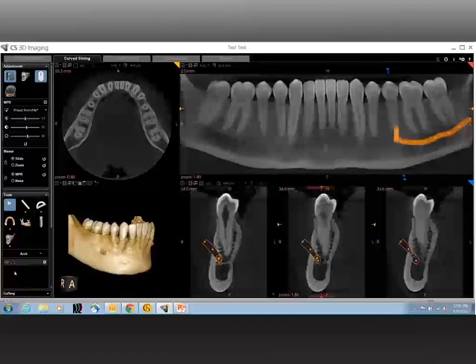Dr. Kottal, I do have one more question for you. I often get asked the question when dealing with a clinician who may not have a cone beam in-house. They ask me, do I have to scan the mandible if the panoramic view, the panoramic 2D radiograph, shows all the anatomy that is needed for implants? How would you comment?